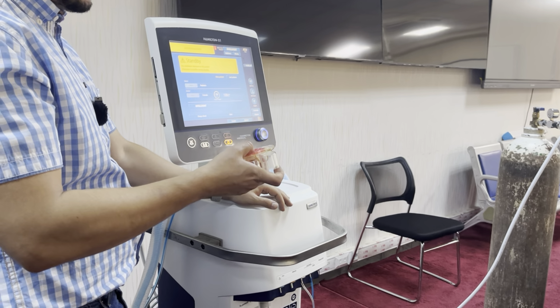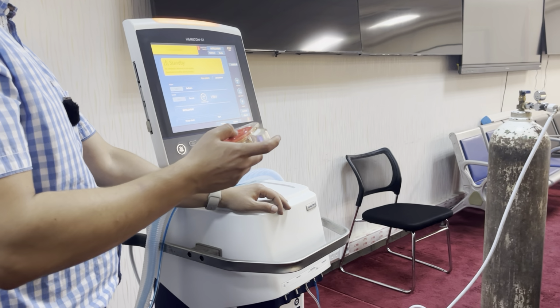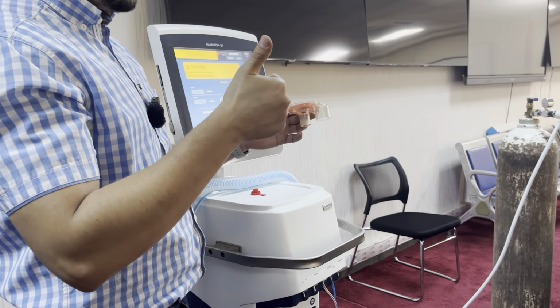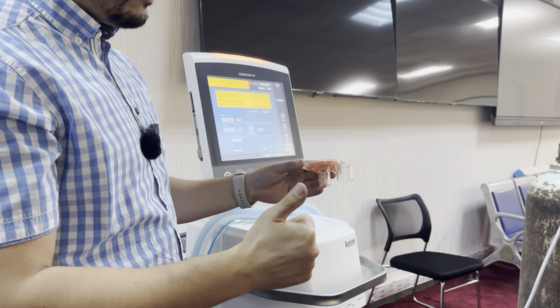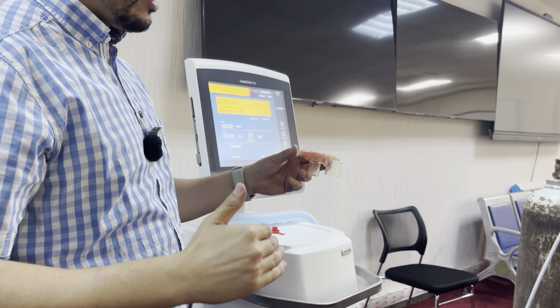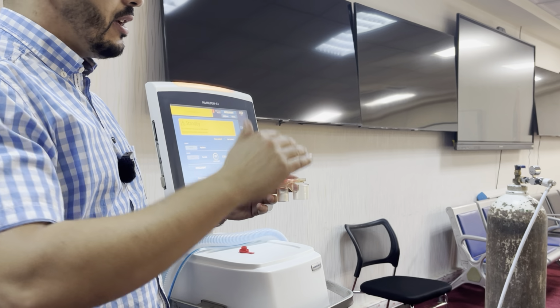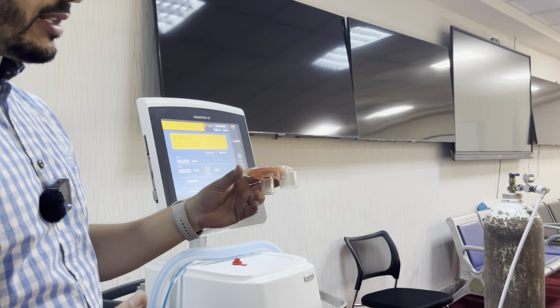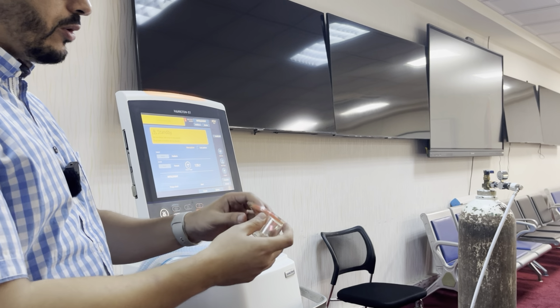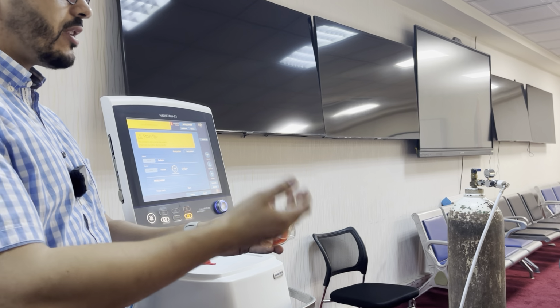Use low temperature sterilizers like plasma or formaldehyde, or we should use solutions. For Hamilton, you can use chemical disinfection. We have a list of safe products with the correct concentration for each plastic part, and you can also use sterilization. But it's very important not to use normal tap water after the sterilization, because it will be recontaminated.